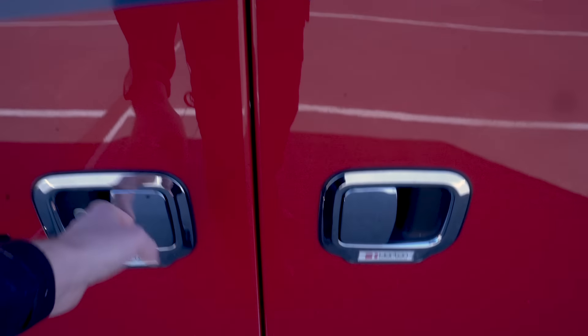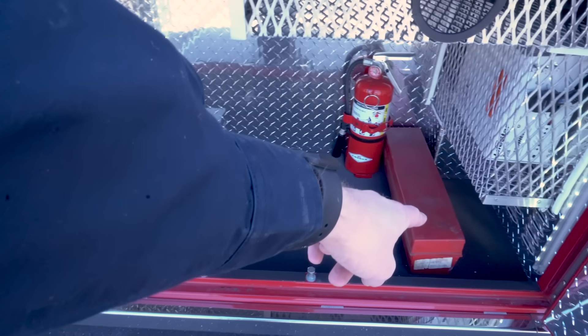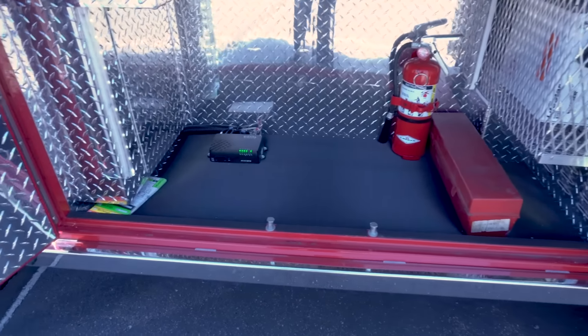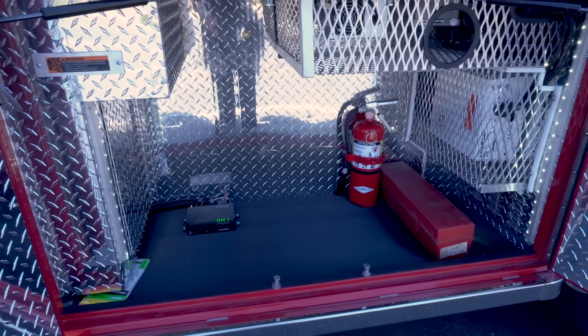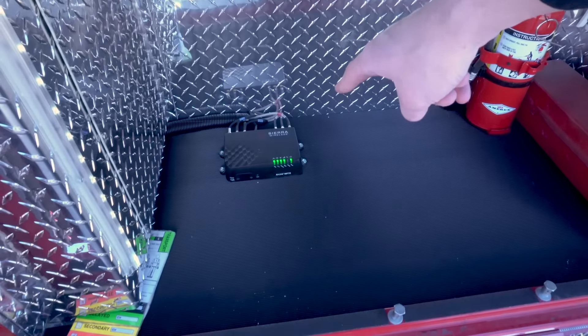Down in this cabinet, it's really quite empty. We've got some triage tags, road flares, and a fire extinguisher. We really just use this for storage of the crew's individual gear. All crews are issued bunker gear and helmets, and if you're on a special team, you can put some of that gear back here for your shift. Down here, we've got the router for all the Wi-Fi.